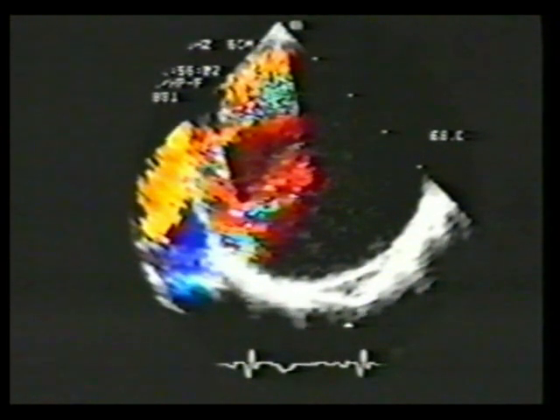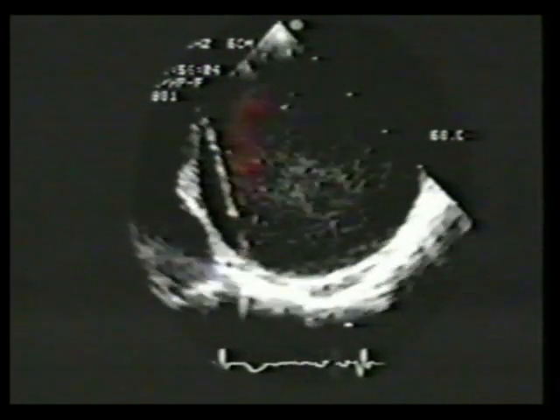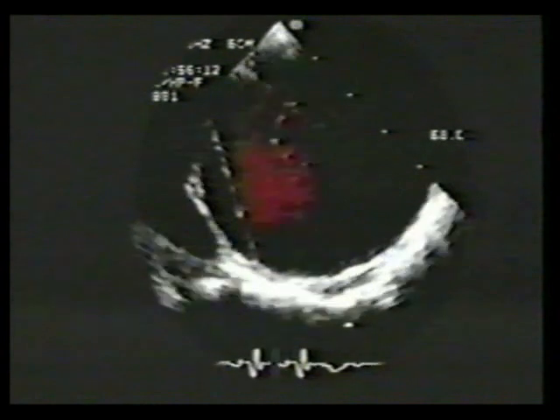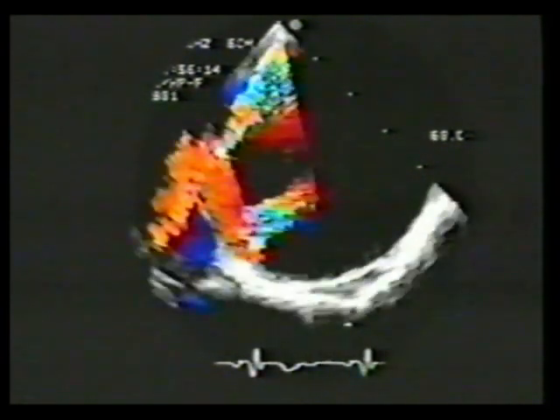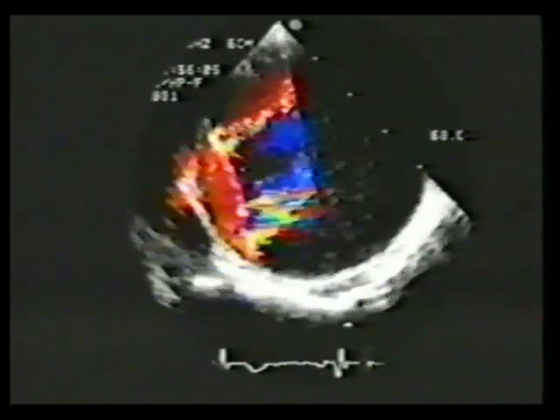In conclusion, the combination of surface and transesophageal echocardiography with Doppler and color flow imaging provides the clinician with a powerful and versatile approach for patients with diseases of the aorta. Both surface and transesophageal echo can be completed at the bedside with immediate feedback of results. The comprehensive information that is provided by echocardiography usually allows a surgical decision without need for ancillary testing.